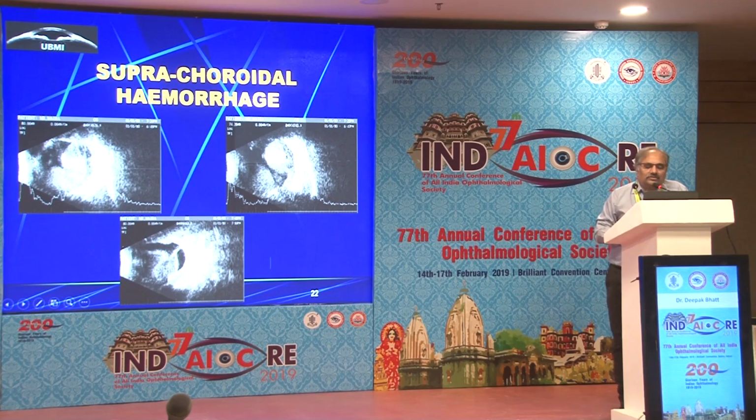So this was a case of a spontaneous suprachoroidal hemorrhage, which has sort of resolved on its own after a few months. It's not completely resolved. It resolved on its own, and we have started seeing the suprachoroidal hemorrhage very clearly. And there was an associated vitreous hemorrhage in front of the optic disc, which was masking our diagnosis earlier. At this stage, I told him that, okay, fairly good, you don't have a mass lesion. So he said, I don't want to do anything at all.